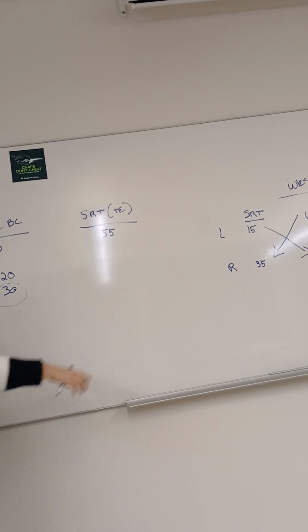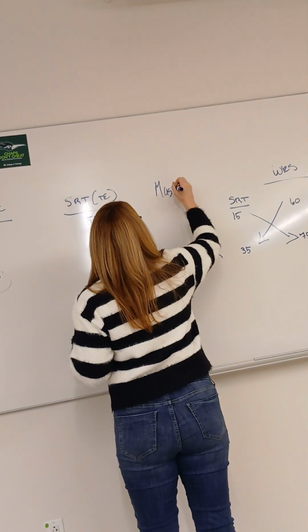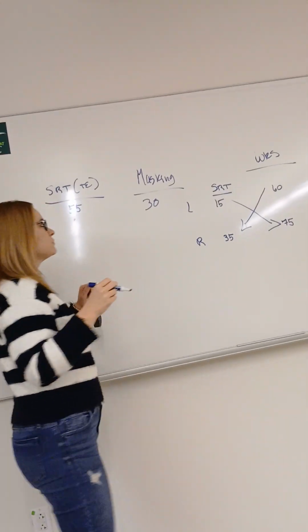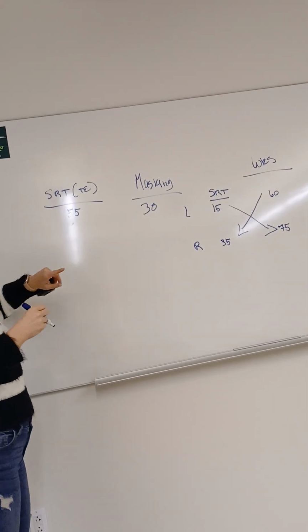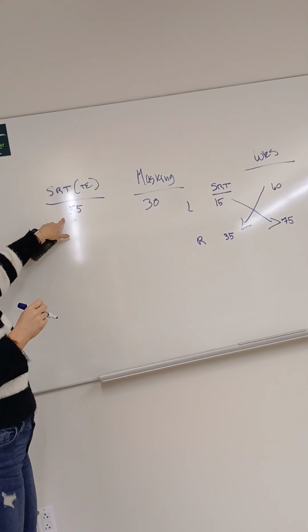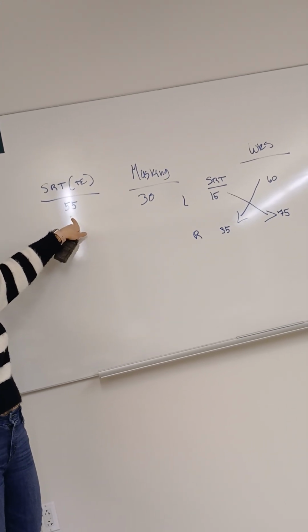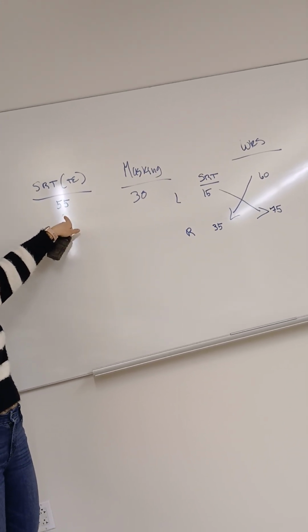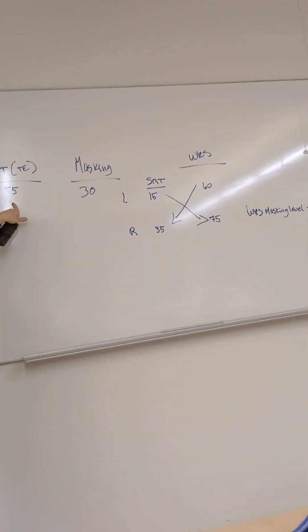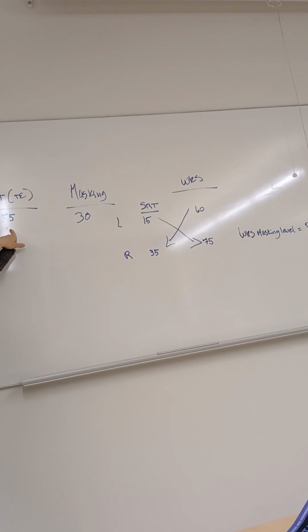Okay? So then we present our SRT, I'm going to move this over here. We're starting at 30. Then 30 for SRT.